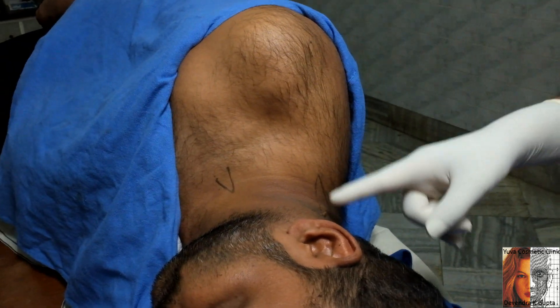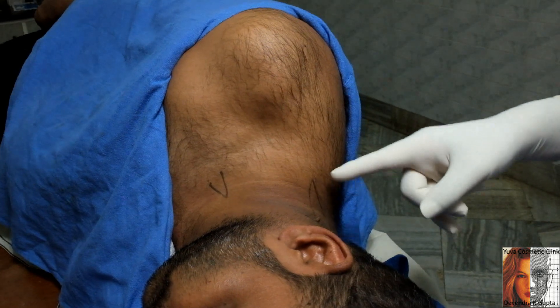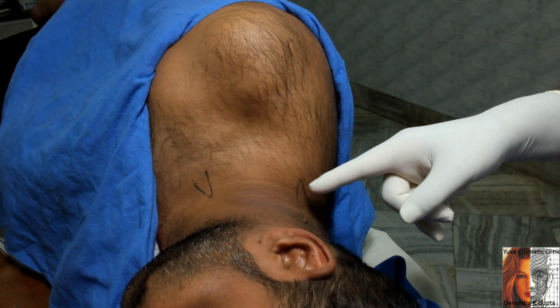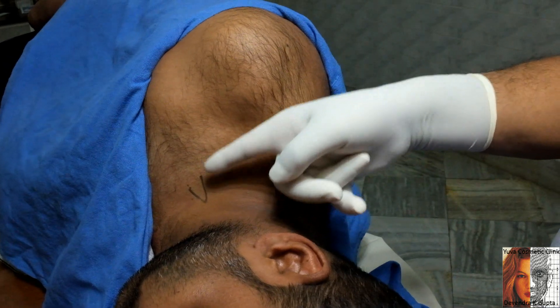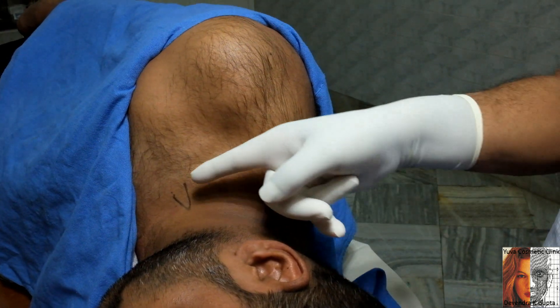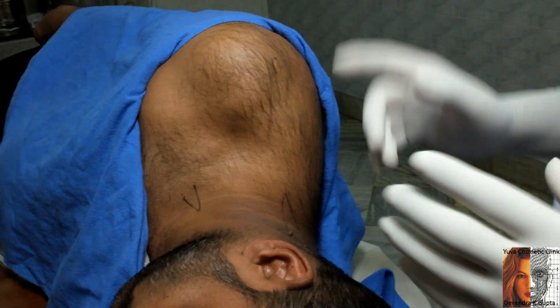I have marked the triangle here. This is the trapezius muscle and this is the levator scapulae. Here I have marked the interscalene space. The direction of the needle is from this triangle to this triangle, so this is in fact a posterior approach — we can also call it a deep cervical block.